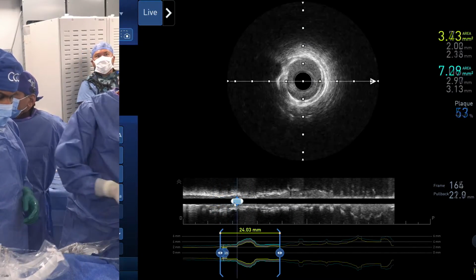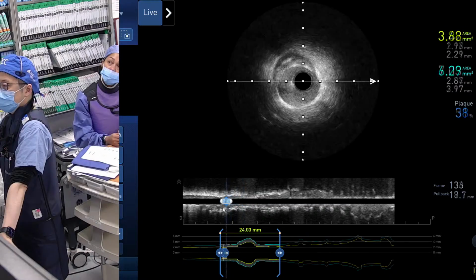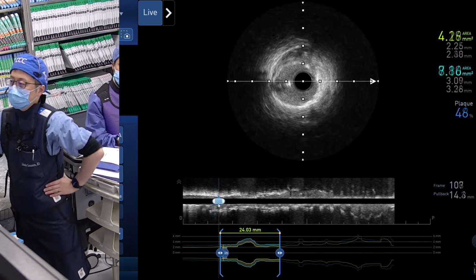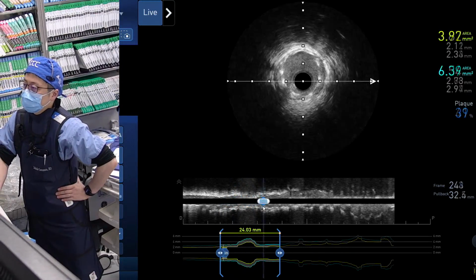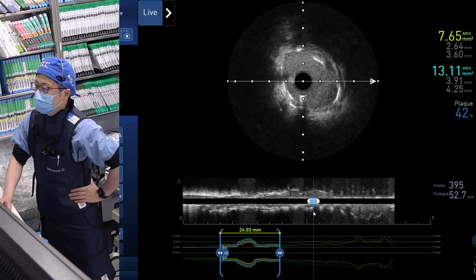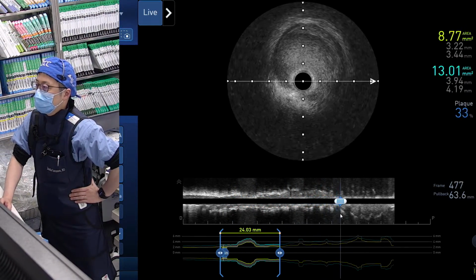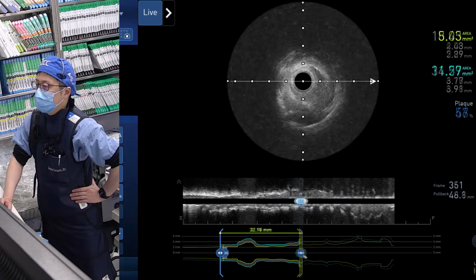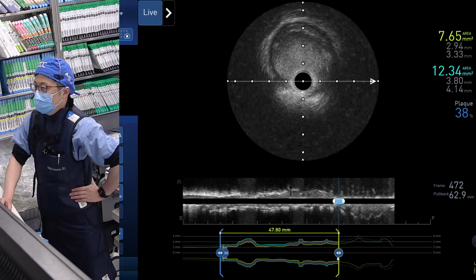Actually, the distal stent area is like a 3 point something, like 3.8, but the distal reference is less than 3, so it's more than 90% expansion. Excellent. I think it's an optimal stent expansion, intra-stent. Wonderful. And proximal is much bigger, with no malposition and no dissection. So I think the stent is perfect. Okay. Good. Side branch. Stent is optimal.